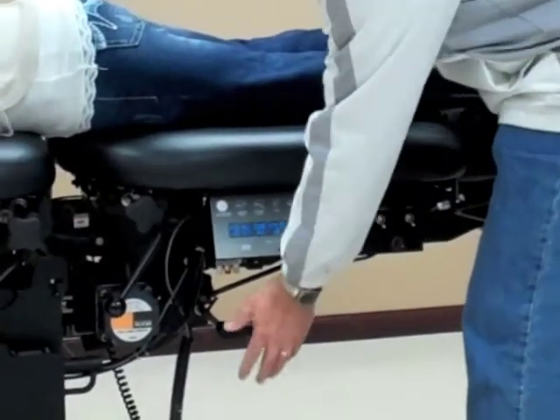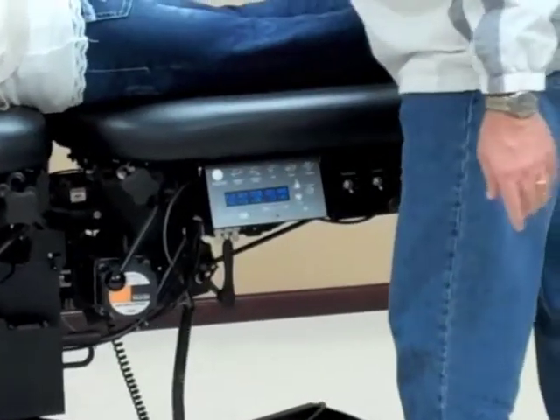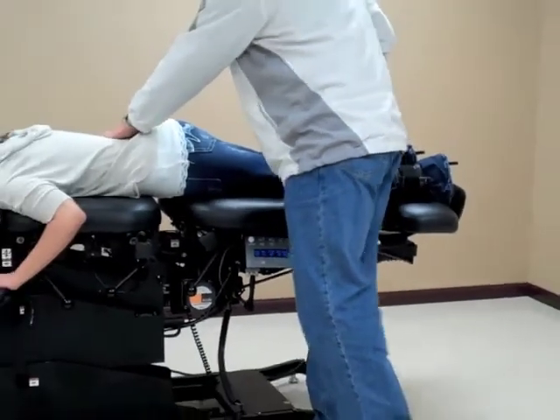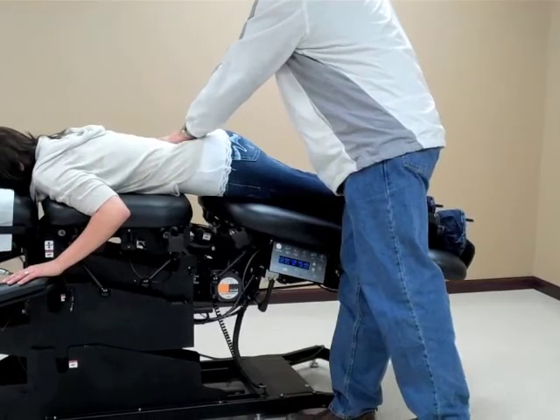The first thing to engage the manual flexion: I'm going to release the lever here upward, and at that point I'm able to do my manual flexion by securing and taking the table, flexing downward.